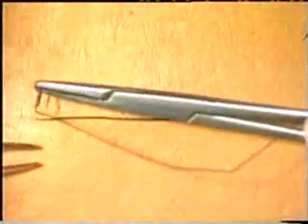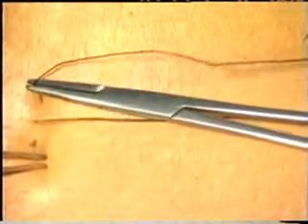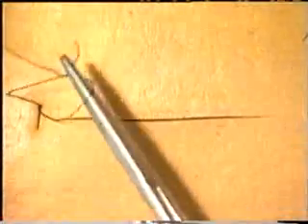We are now going to close the same incision using a continuous suture technique. Insert the first suture as before at right angles to the skin edge and ligate this using a standard reef knot. However, in this situation, just cut the short end and hand the long end of the suture to your assistant, who will follow you during this procedure.